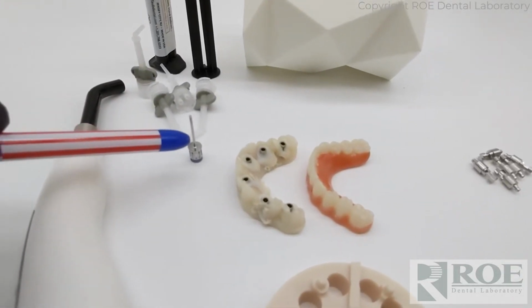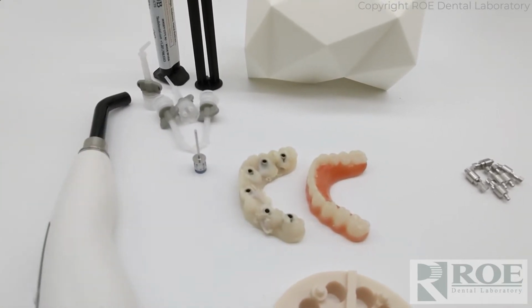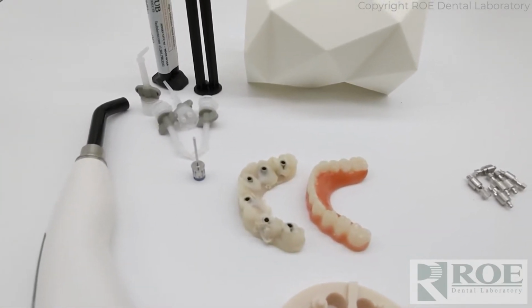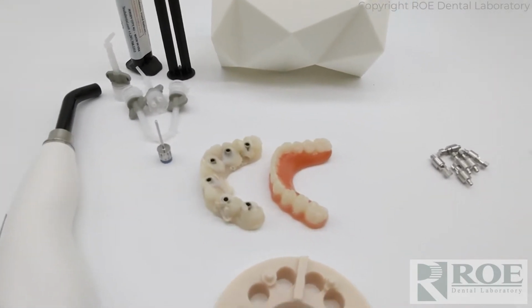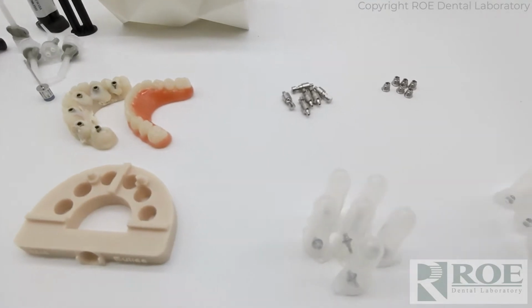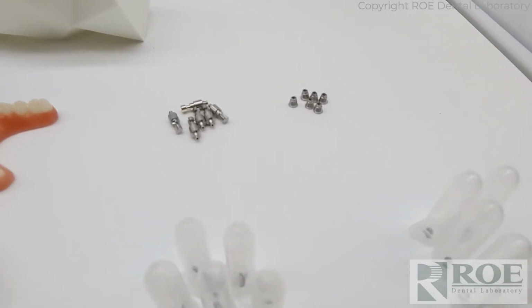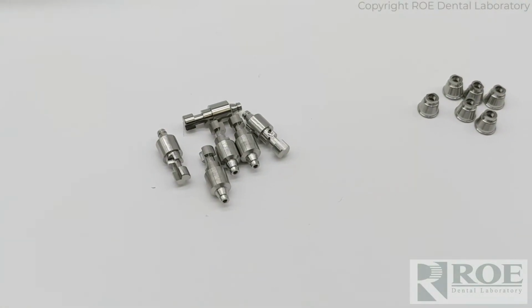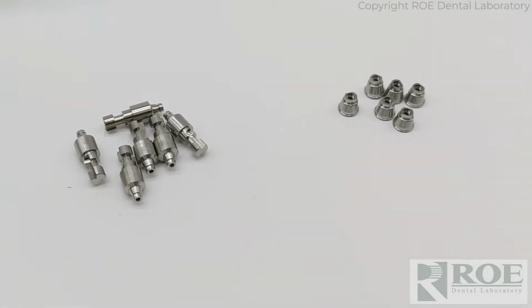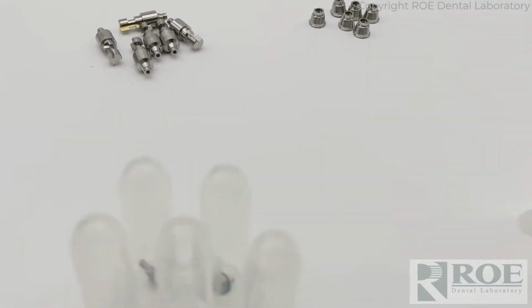You'll need a driver for the screws, and the screws for Smileloc are Nobel compatible. So in this case, we're just going to use an 048 driver with some Nobel compatible screws. And then the Smileloc components that are needed are analogs in order to make the model, copings that will fit inside the prosthetic.